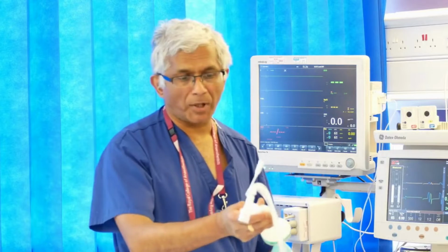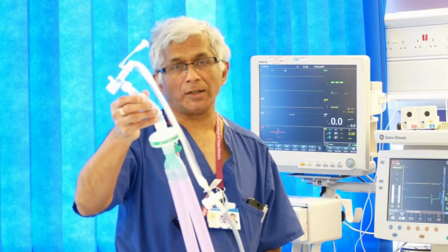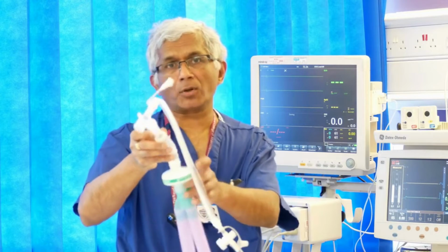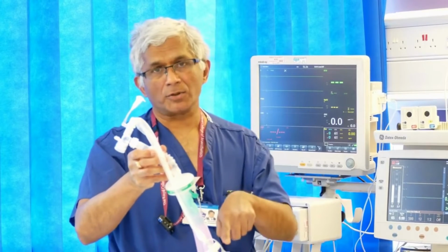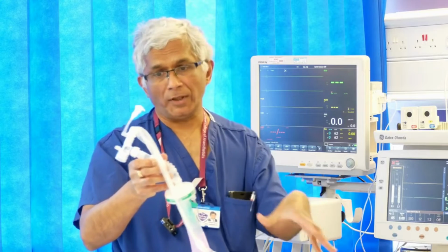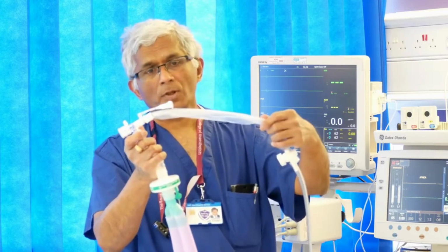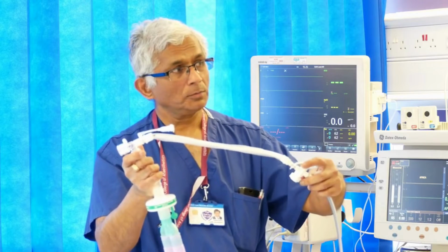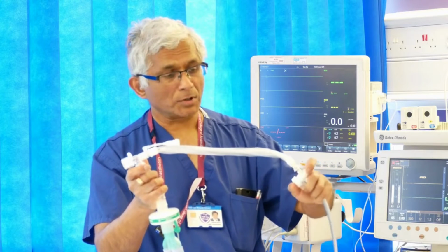When you come to see the patient, they will be connected to this breathing circuit. You will see a few components. We call it the catheter mount, and it's a closed circuit, so it's not open to the atmosphere. This tubing is for the suctioning purpose, so it's all sealed. So does that mean that even if the patient is COVID positive, I'm not going to be exposed? You won't be exposed. Yeah.